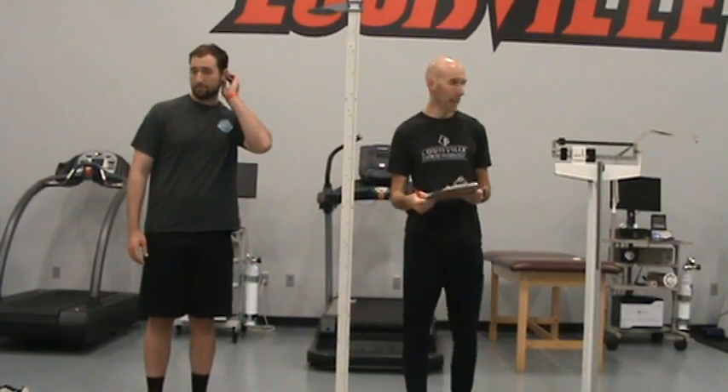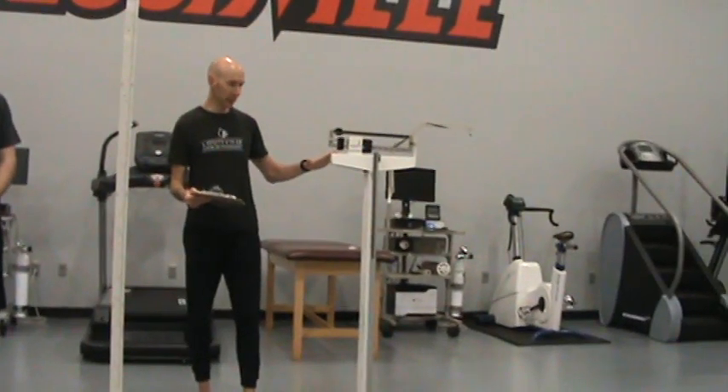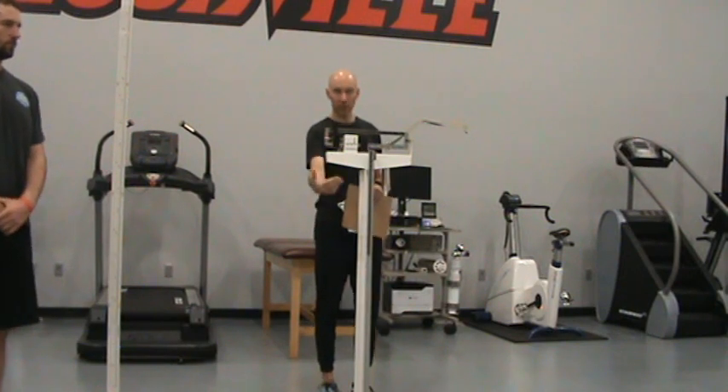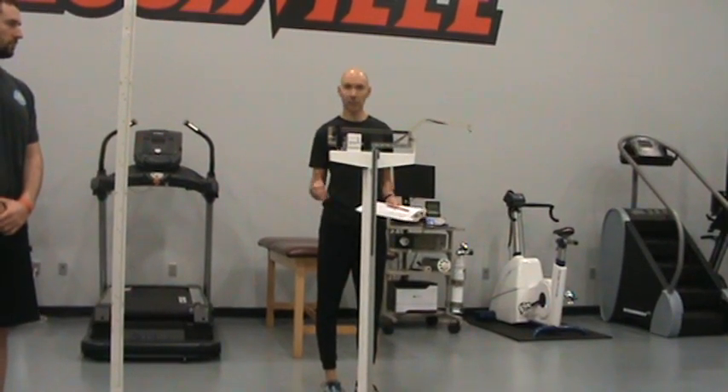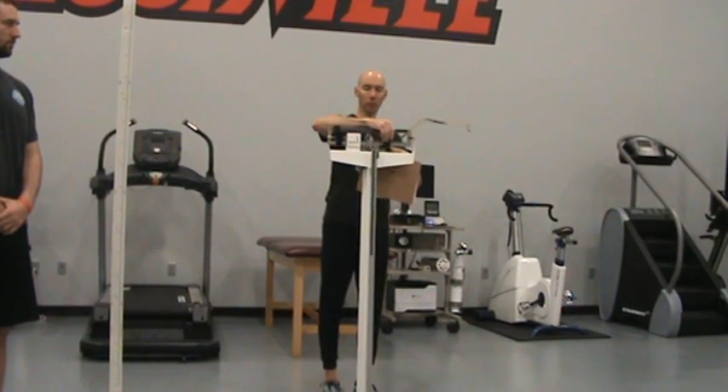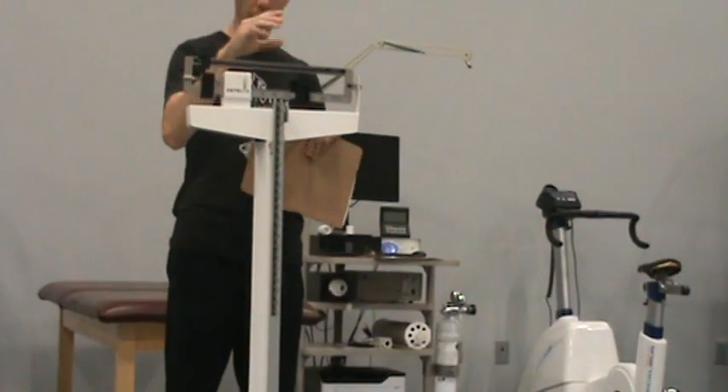Next we will take the subject's weight using what is known as a certified balance scale, more commonly referred to as a doctor scale. Again, we take this measurement with the subject's shoes off. As the administrator, I usually stand on the back side of the scale and the subject stands on the scale facing me. I typically ask subjects what they anticipate they weigh — that saves me from guessing. Once they give me a number, I move the large weight on the slide to the closest number without going over, then move the top slide weight until the pin balances neatly between the scale sides.